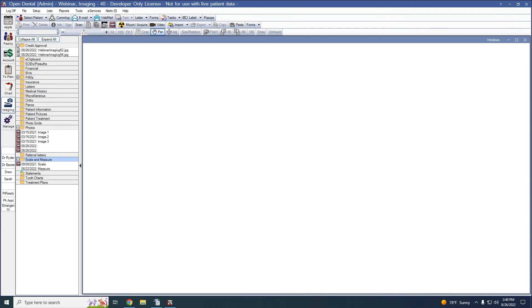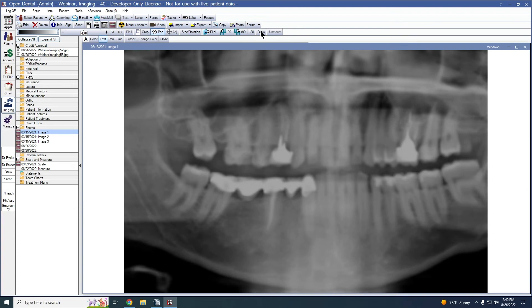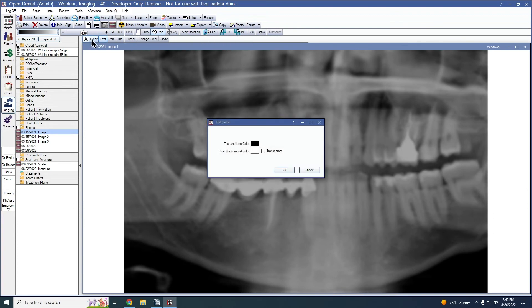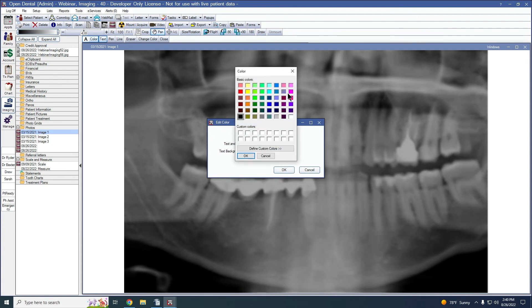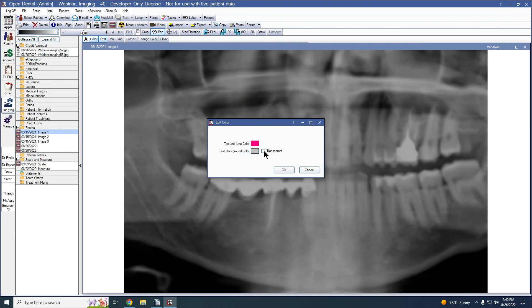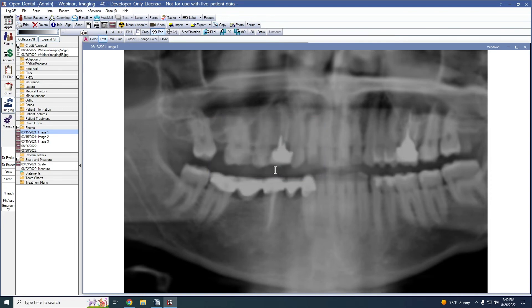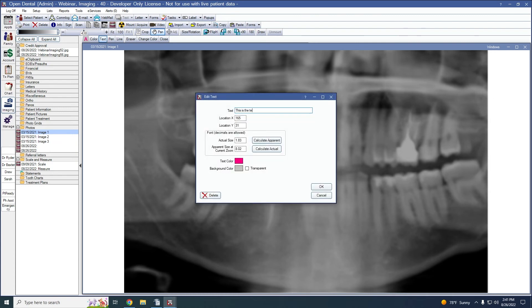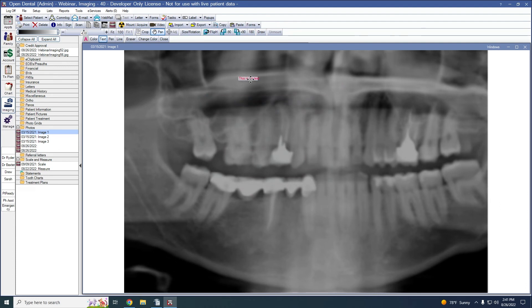Now let's take a look at some of the other features on the draw toolbar. To open the draw toolbar, select an image and click the Draw button. On our draw toolbar, we can click Color to set the default color for lines and text on our x-ray, as well as the default background color, or choose to make the background transparent. To add text to the x-ray, I can click the Text button and then click where on my image I would like my text to display. I can edit what I would like the text to read, as well as its x and y positions on my image. I can change the font size, the text color, and its background color. I can also make the background transparent. I can also move my text around the image by clicking and dragging.